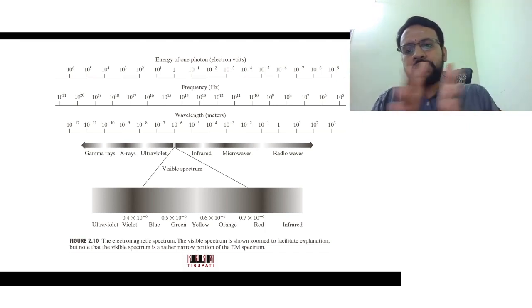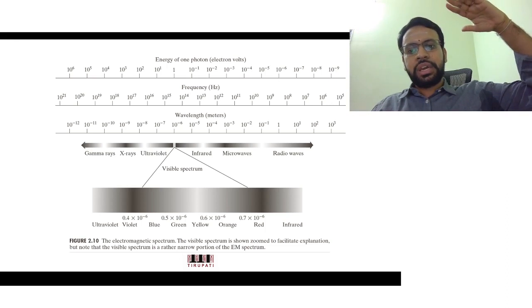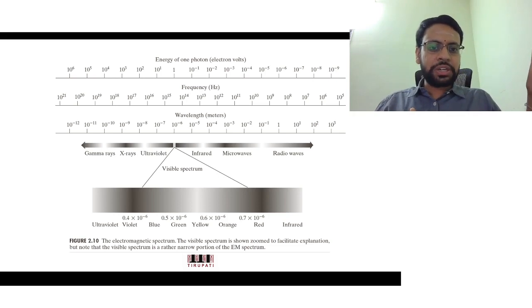Now if we move on to the higher energy side, X-rays we have seen, that's all the computed tomography, X-ray based mammography, and chest X-rays, which we have discussed, and nuclear medicine uses gamma rays. On the other side of the spectrum, we have not gone into the details of MR imaging, but it is enough for the time being to know that it uses radio waves.